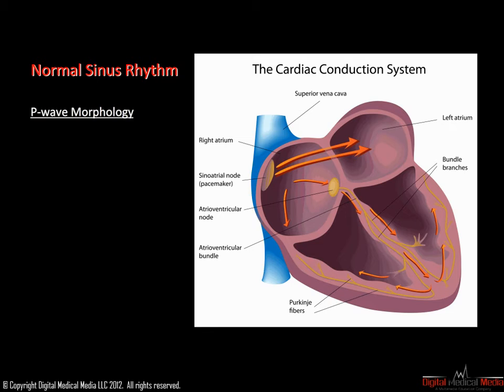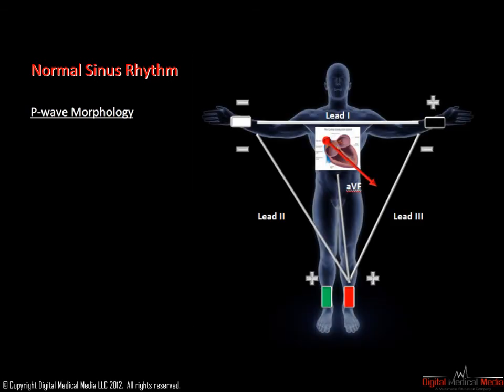The following set of instructions deal with vectors in the heart. Since the sinus node is the highest and most right lateral position in the right atrium, then any rhythm originating from this location must move from the top of the heart down and from the right side of the heart towards the left. This is simple geometry. Therefore, lead 1 is positioned in such a way that it spans from the right arm to the left arm. Therefore, a sinus P wave should be upright in this lead.